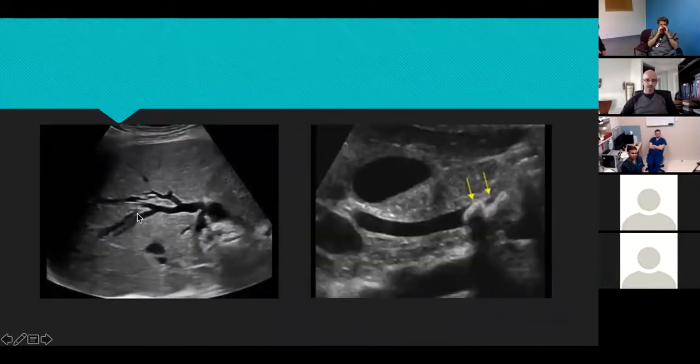The other interesting thing, again, this is a common question. You can see there are two tubes running side by side. Remembering from the anatomy, the biliary system and the portal system run together. Usually with the portal vein branches, you just see them on their own because the intrahepatic bile ducts are so small that usually you don't see them, or if you do, they look very teeny tiny.